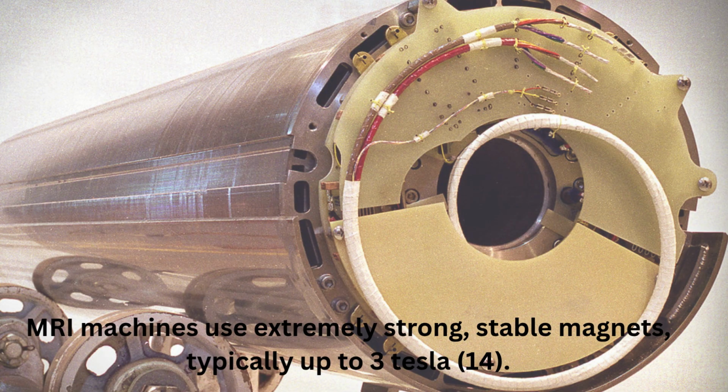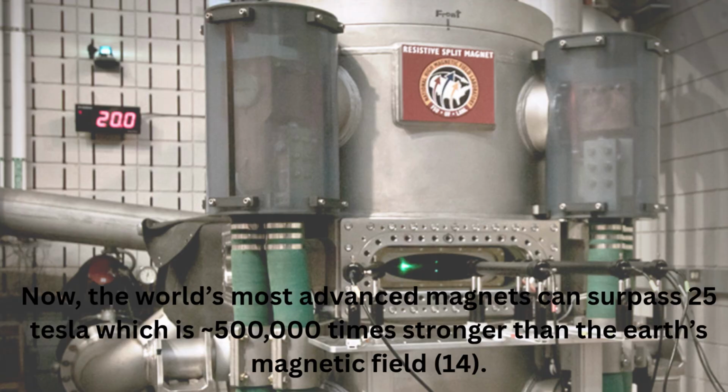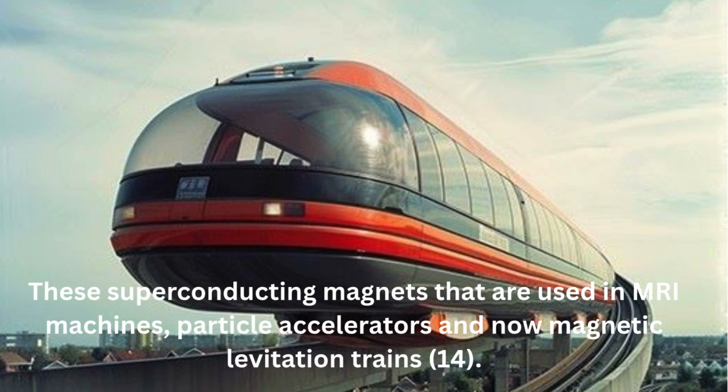MRI machines use extremely strong, stable magnets, typically up to 3 Tesla. They rely on superconducting magnets, which have no electrical resistance when cooled to cryogenic temperatures using liquid helium, which is around 4.2 Kelvin or -269 Celsius. Now, the world's most advanced magnets can surpass 25 Tesla, which is 500,000 times stronger than the Earth's magnetic field. These superconducting magnets are used in MRI machines, particle accelerators and now magnetic levitation trains.